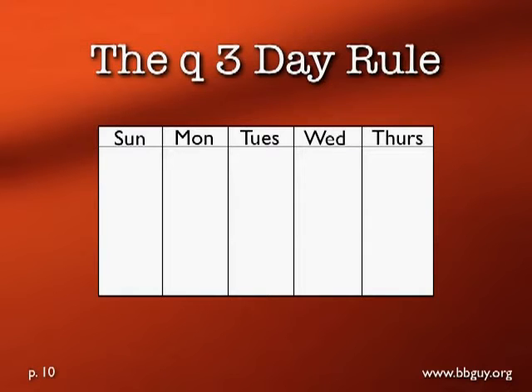It's Sunday. They get their sample drawn for pre-transfusion testing. They may need a transfusion. We're not sure. And it's 2 o'clock in the afternoon on Sunday. So that sample gets drawn. Sunday immediately becomes day 0. Obviously, Monday, day 1, Tuesday, day 2, and Wednesday, day 3.